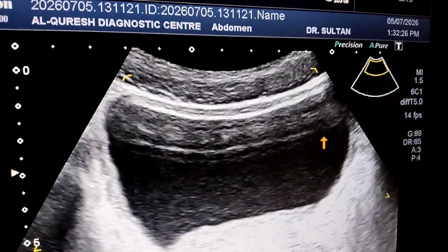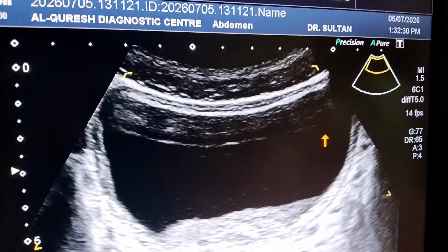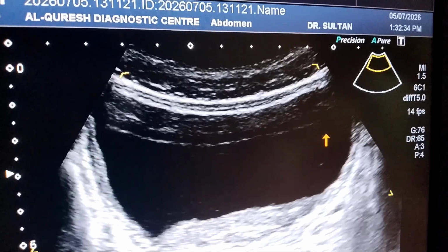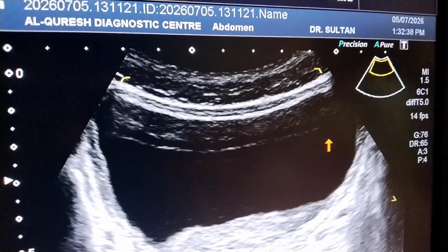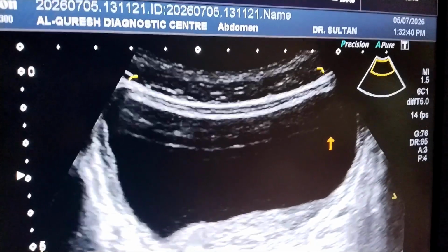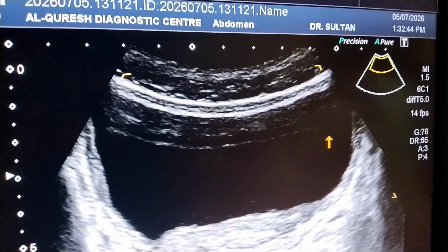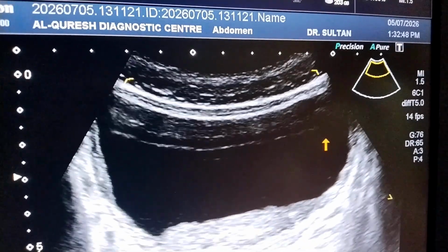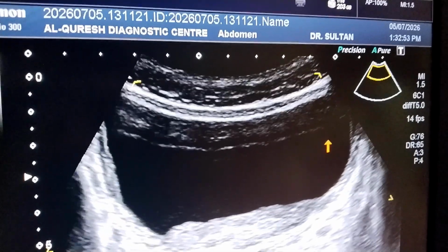We call it acute. So when you are going to measure the wall thickness, decrease the brightness and then measure it. While measuring it, we should also zoom the image and also decrease the brightness. While decreasing the brightness, we can appreciate the exact wall thickness and also the fluid debris level.